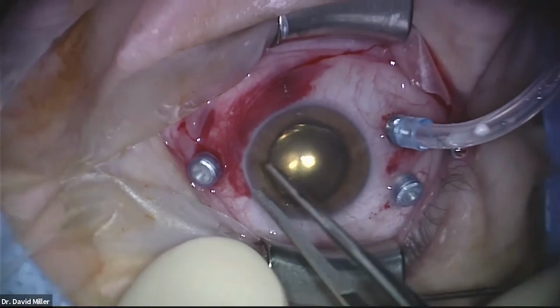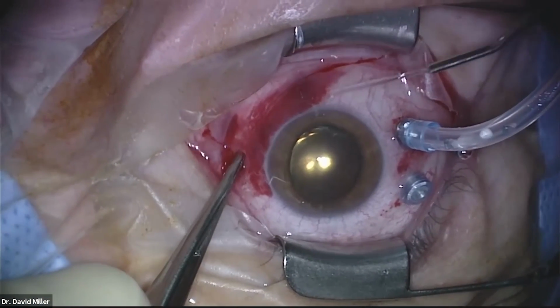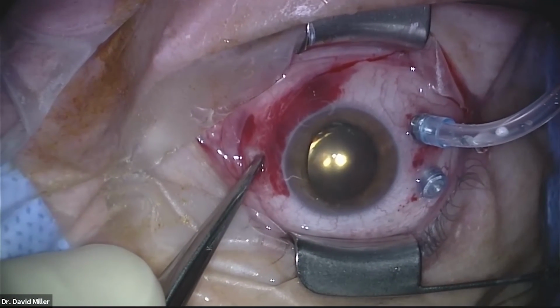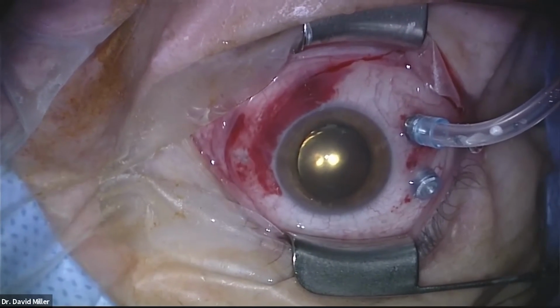Okay. One thing about how he was detaching, but not all the way up to the gas bubble, it also gives you a clue that the tear was somewhere towards the very bottom. If it was all the way up to the gas bubble, those are the ones more commonly that get exposed when the gas uncovers a tear on its way up. So that tear site looks like it's not leaking. We're in good shape.